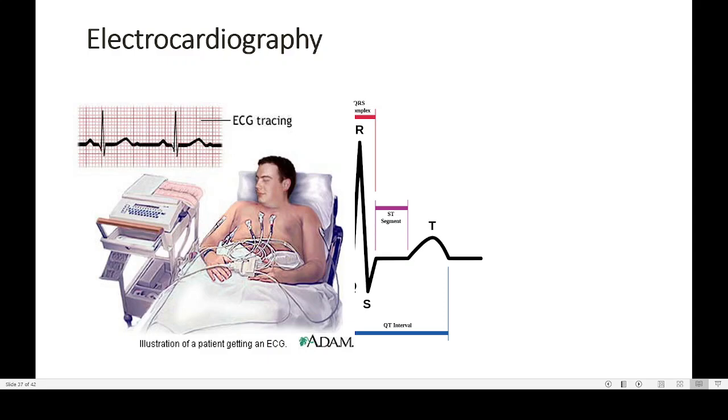And now medical biologists have collected so many ECGs in different situations. That is what we have seen earlier. Each disorder produces a typical pattern of ECG. So that is why they are taking ECG. That is why ECG is so important. This is how you will be able to get an idea of the various abnormalities of the heart.